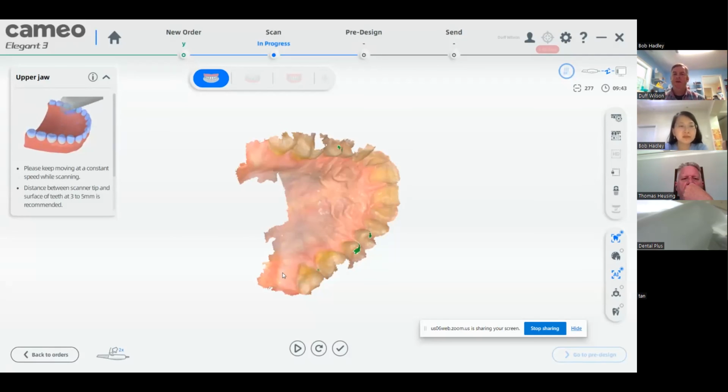I haven't found any software issues, but I'll do the training for right now for ADITE in conjunction with Thomas, and we'll go from there. But I have had very good success talking to other laboratories and showing them how to use it, and feel confident that anybody that would purchase it, we'll have them up and rolling and knowing the ins and outs in no time.